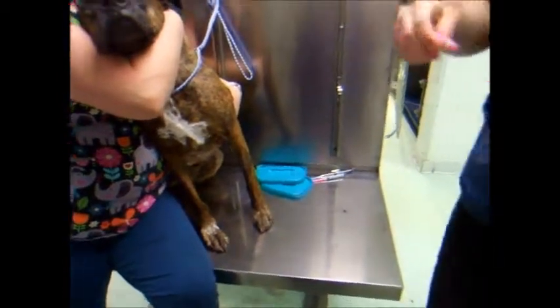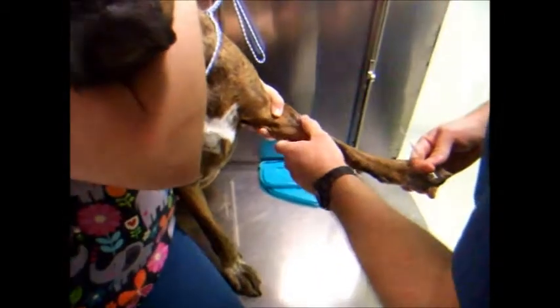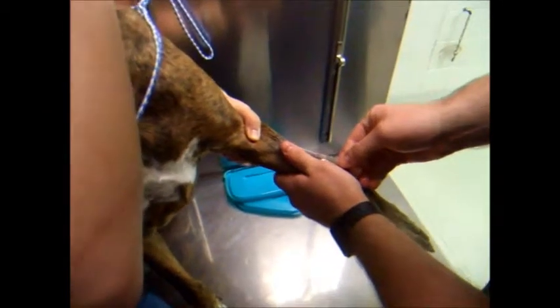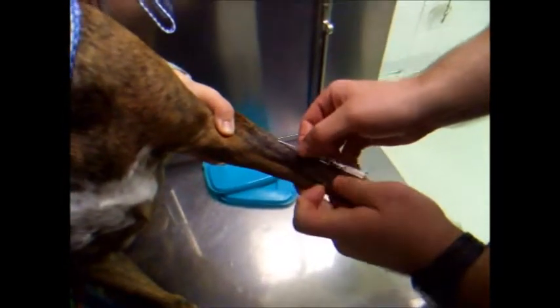So, like I did for the saphenous vein, I'm going to go ahead and look for a flash of blood, and then we're going to advance the catheter. Put a cap in there. So I got my flash. I'm going to advance the catheter.